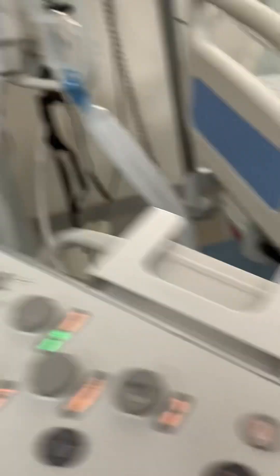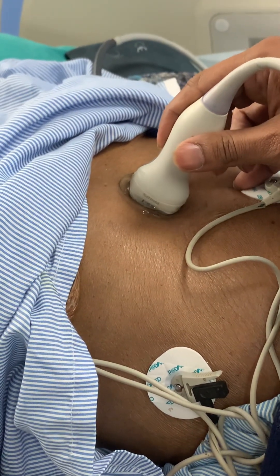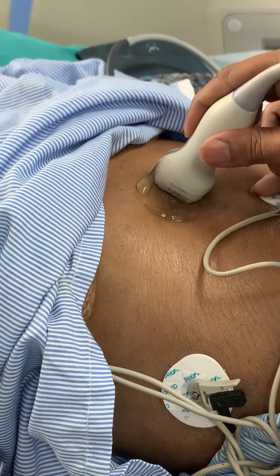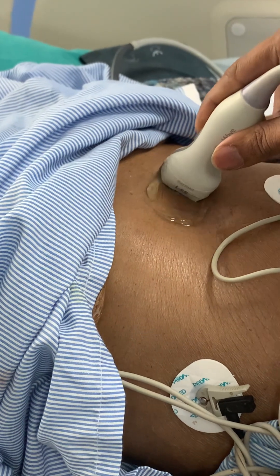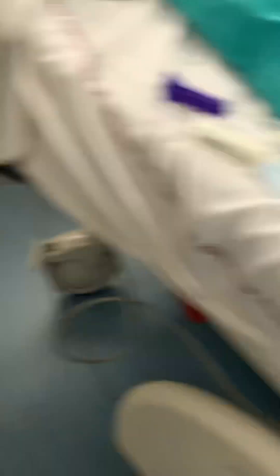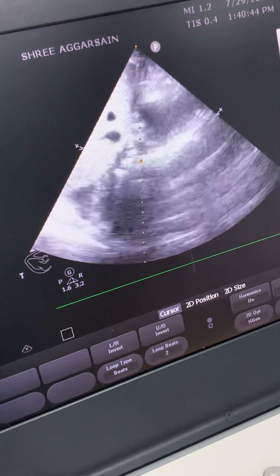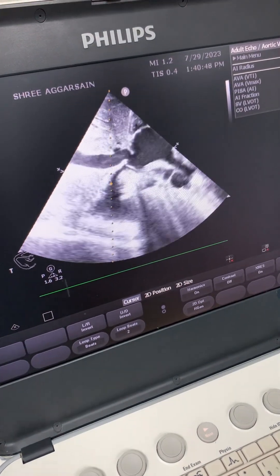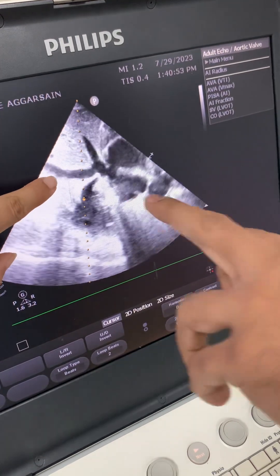There are two probe movements: a sliding movement and a gliding movement. Gliding is this movement, and sliding is when you move the probe away. Using these two movements together, you try to focus and obtain the perfect picture.